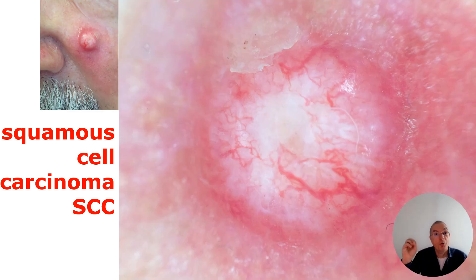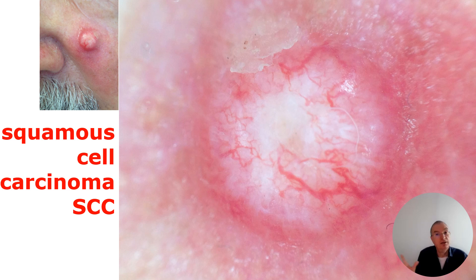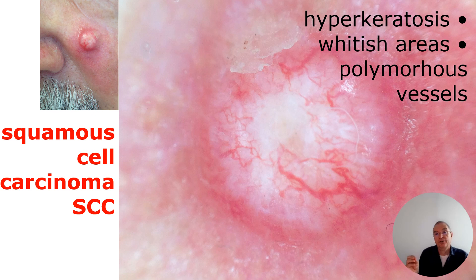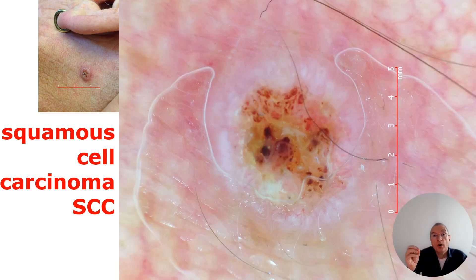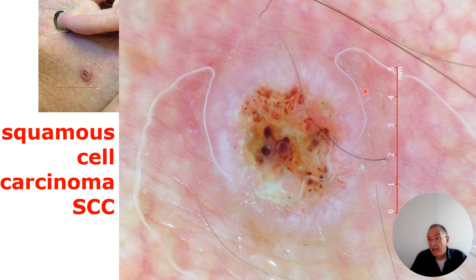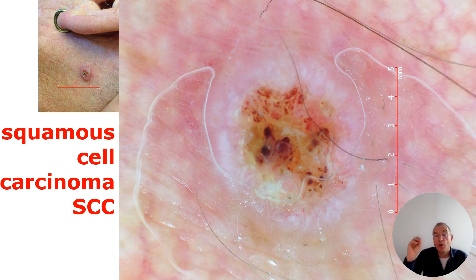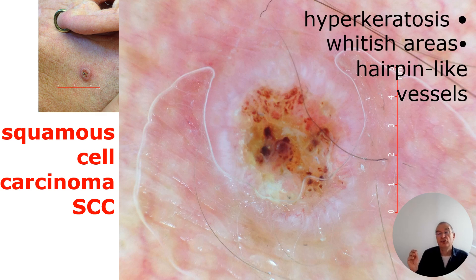A smaller lesion with whitish areas — see the vessels. You might say, oh, this looks a little bit like tree-like vessels. But the whitish areas are for me the hint for SCC. Therefore, I need to do surgery in combination with these polymorphous vessels. We know that we learn from large lesions to small lesions. Hyperkeratotic in the center, but look to the periphery with these whitish areas — therefore, these whitish areas are the hint for the initial SCC.